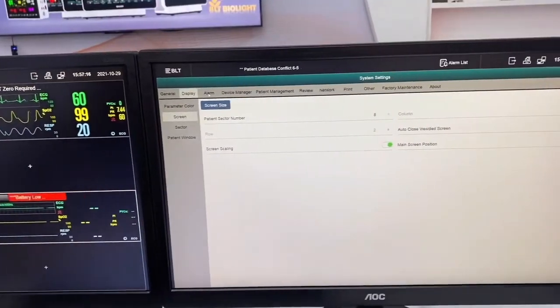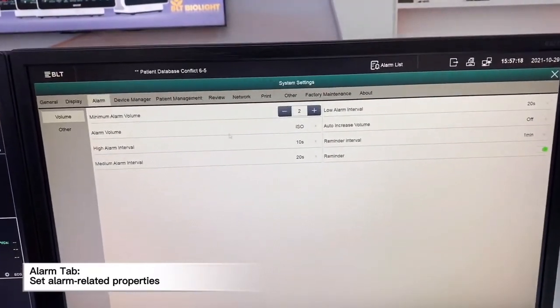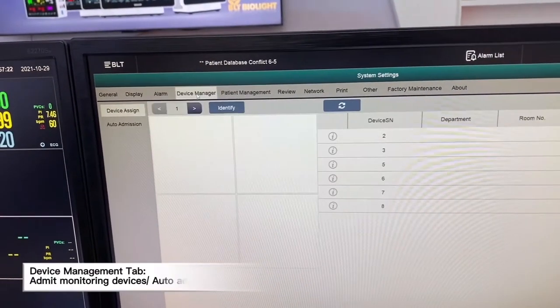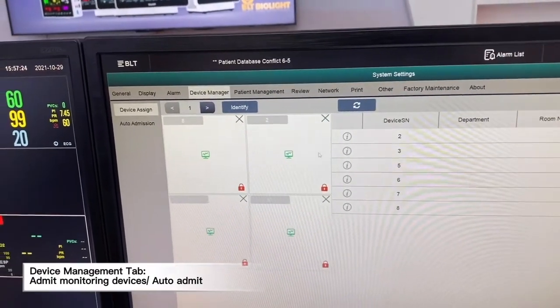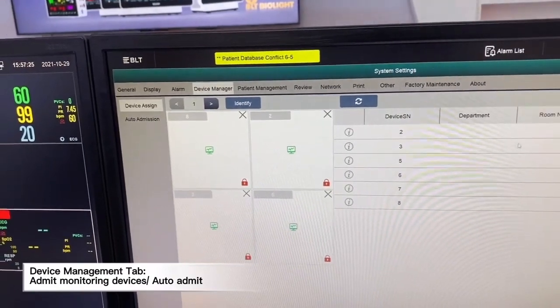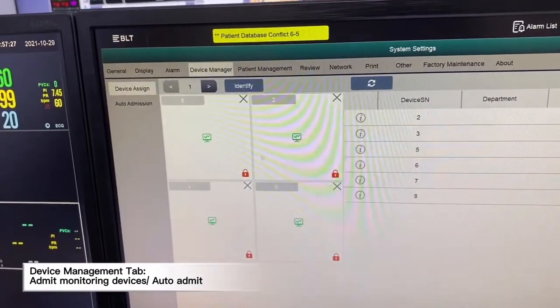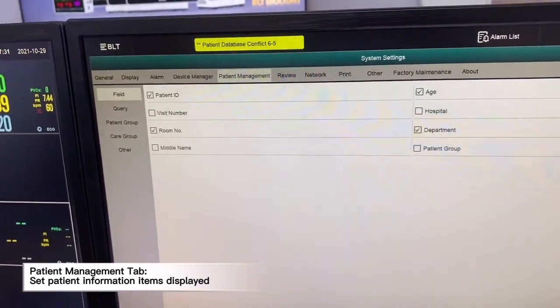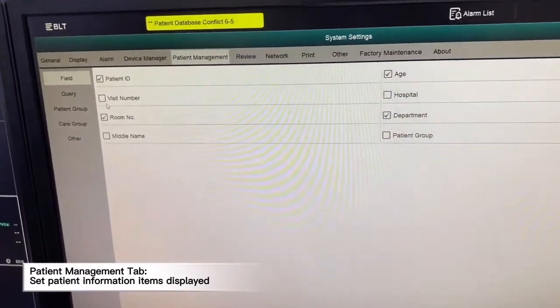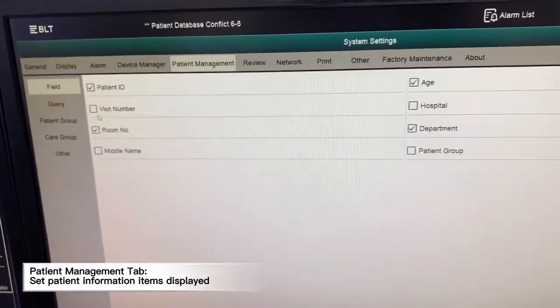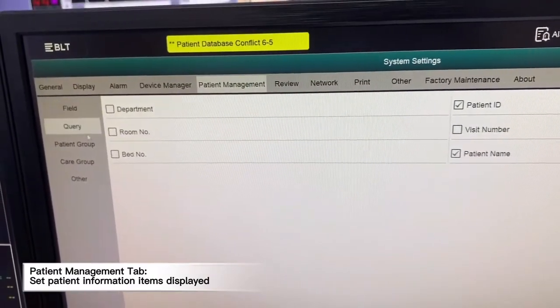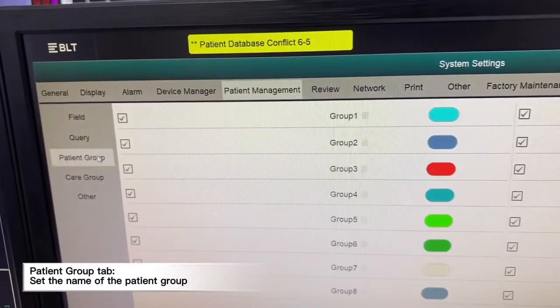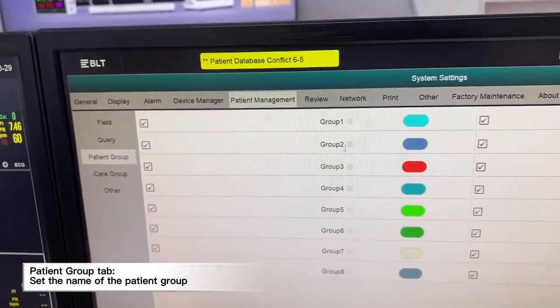We can customize alarms. The third option, we can change the volumes. We can change device management depending on the sequence we want to arrange. When we go to patient management, we can choose the information that we want. We can change the patient group depending on the necessities.